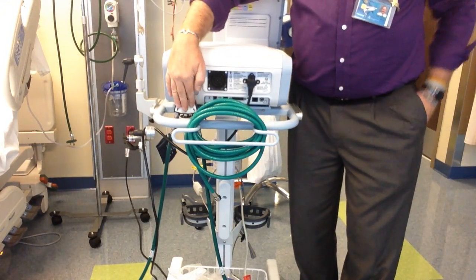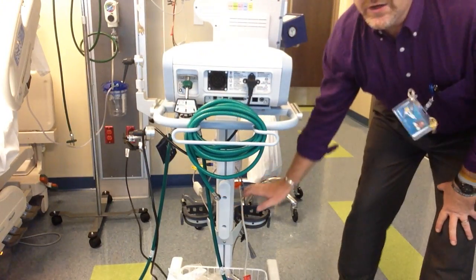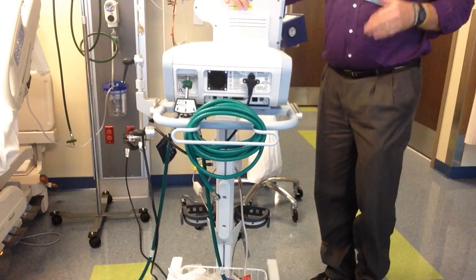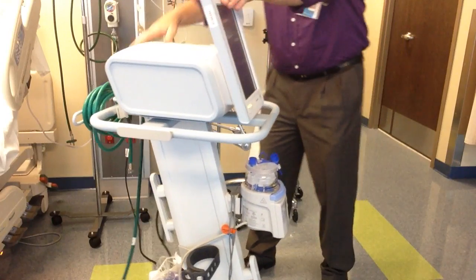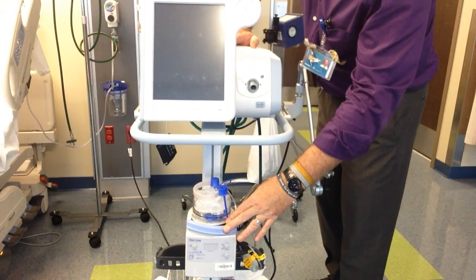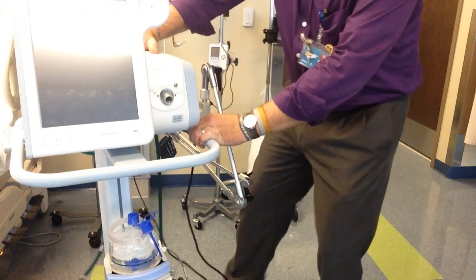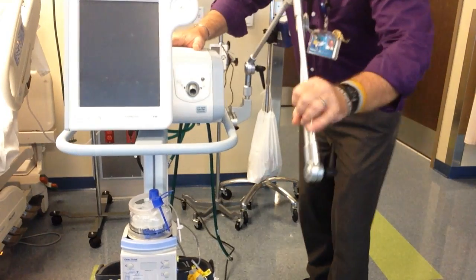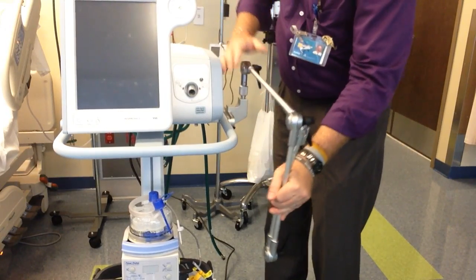Again, this is the oxygen manifold right here. You have one 50 psi hose to go to the wall, two to go to the tanks. The tanks are held here in the holding system. You have a storage basket all the way on the bottom for extra masks, different items like that. Turning this around, as you see, you can do heated humidification on it. We have our Fisher-Paykel heater on it. And turning it to the side, this is a support arm to hold the BiPAP circuit and just get it to where it's comfortable for the patient.